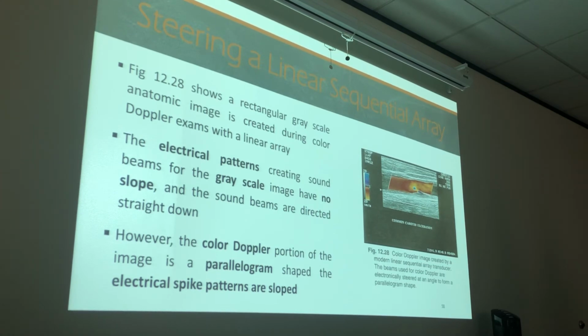The technology of electronic focusing and steering works the same. If the elements are struck in a slope pattern, that means it's steered. So, I don't know, maybe you're covering focusing right now. Here I got confused. Beam focusing, how do you focus this linear array? You tell me. Is it a multi-focus? It can be. I'm just trying to fill out the worksheet. But that's not helping you understand it though, right?